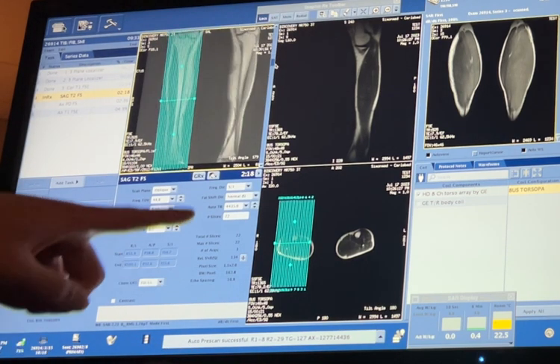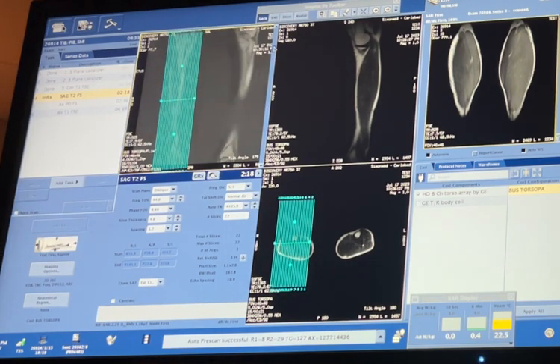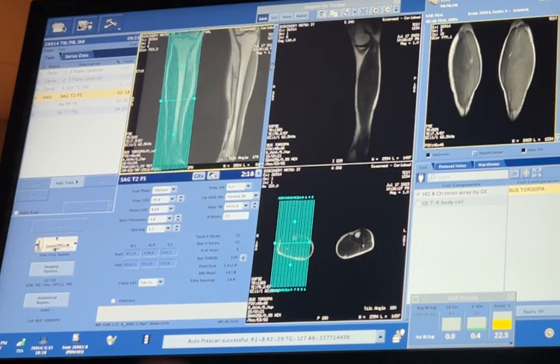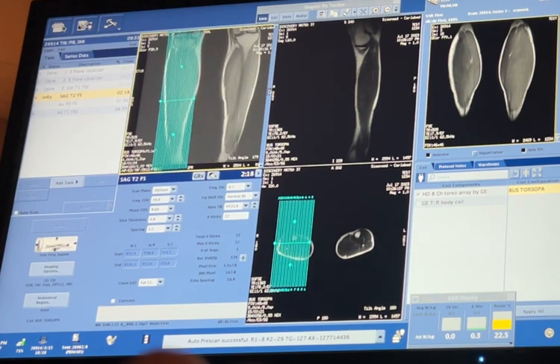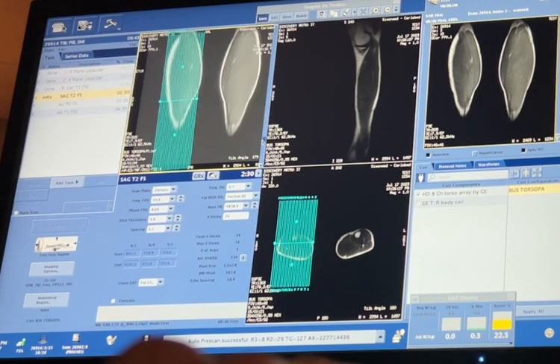We have it straight down here, so that looks good. Let's scroll back and forth and make sure we're not cutting anything off. One more. Okay, so we can add slices right there. Yeah, perfect. And then keep going. All right, that's good.